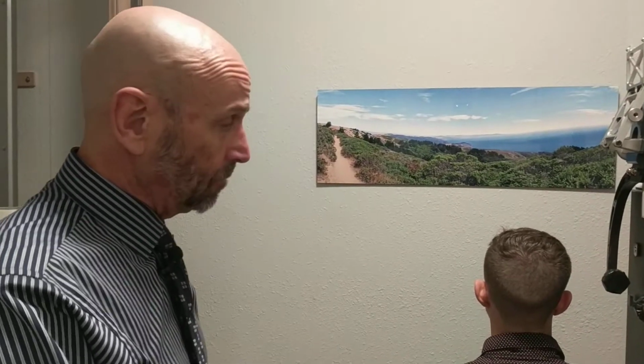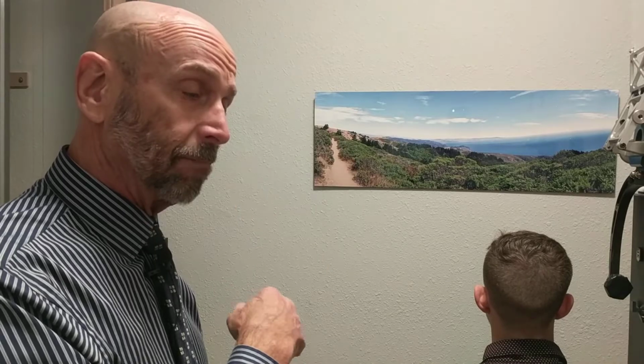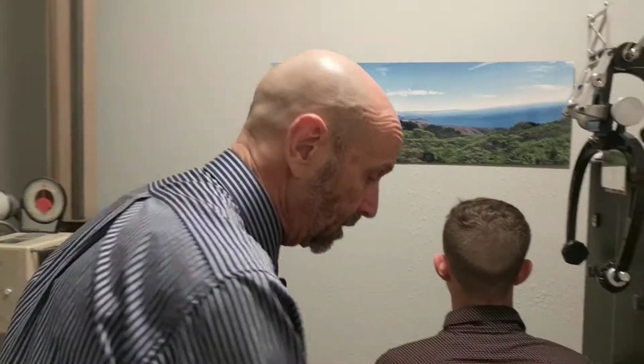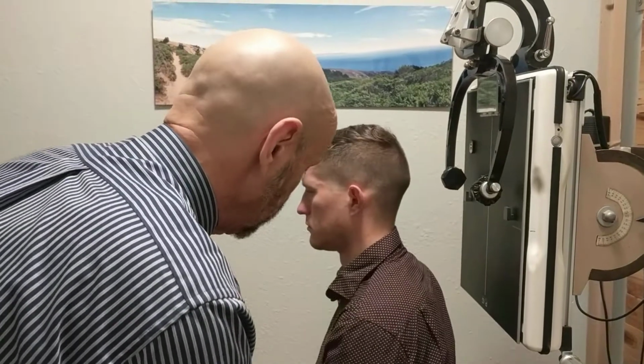So after we've taken the lateral, the next view that we can take is the Nasium. The Nasium draws the angle from the lateral, so we need to have that first. So let's say that we're going to set for an S3, and that's explained in other parts of the presentation.